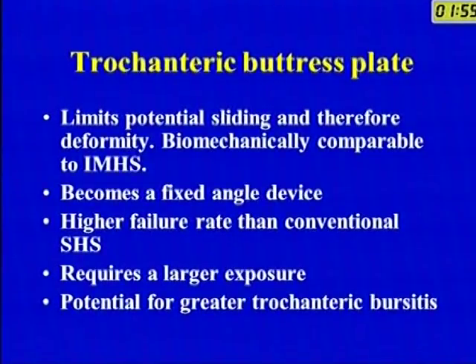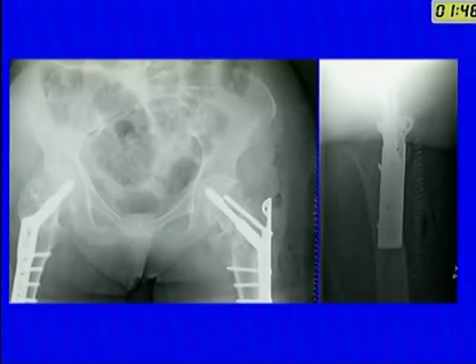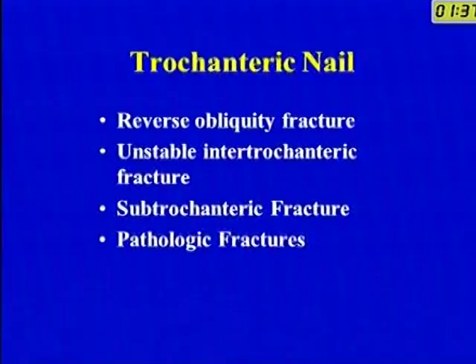Overall, the rate of complications for this is higher. It requires a larger exposure, and it doesn't always work, like in this case. Despite the presence of the trochanteric buttress plate, it has shortened and there is penetration of the implant.